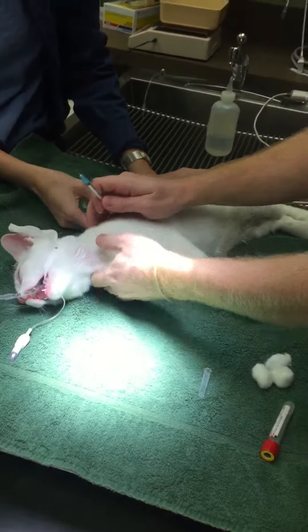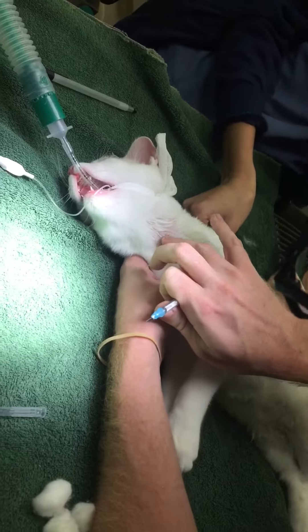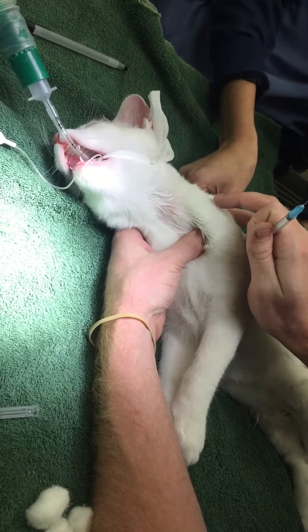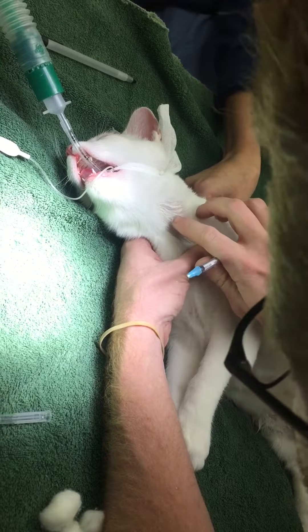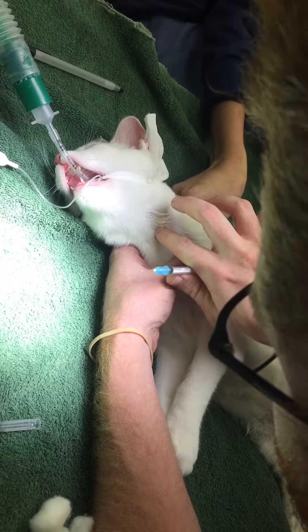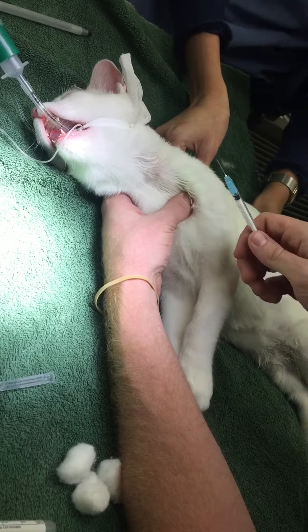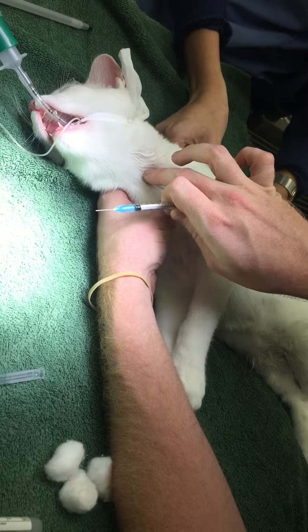I'm going to go ahead and distend the vein and find where I'm aiming for. Now that I've found the vein, I'm going to insert with the bevel up, as quickly as possible.